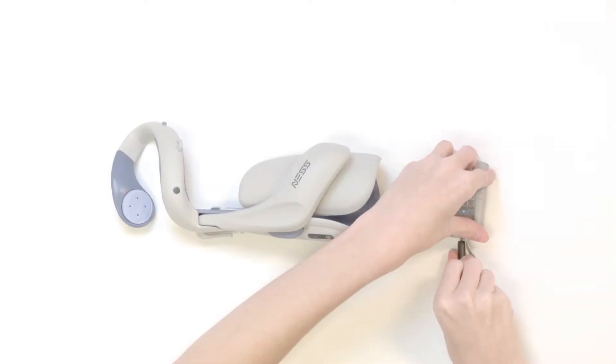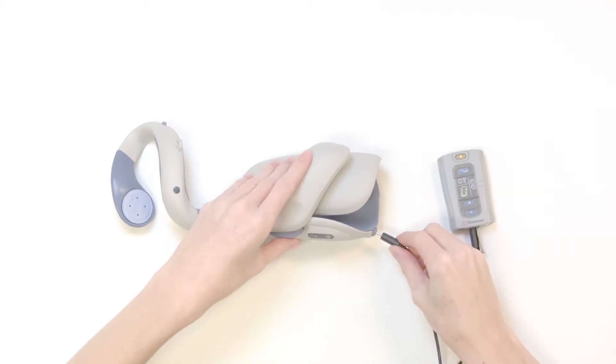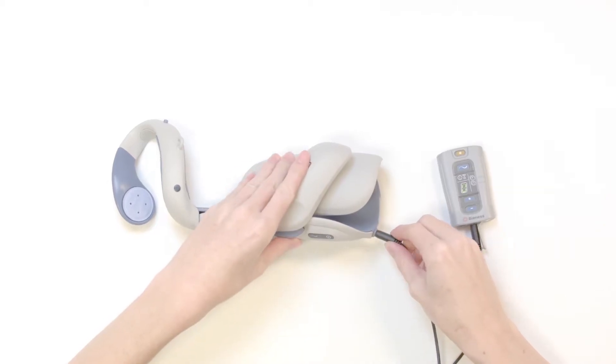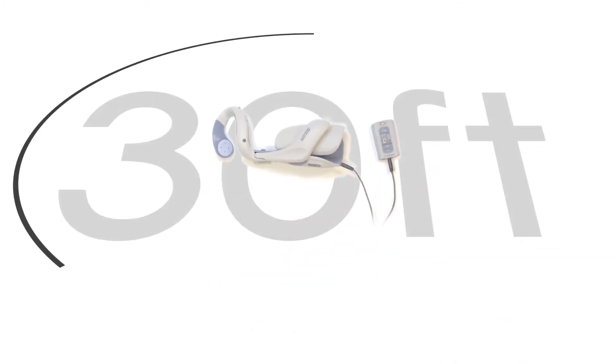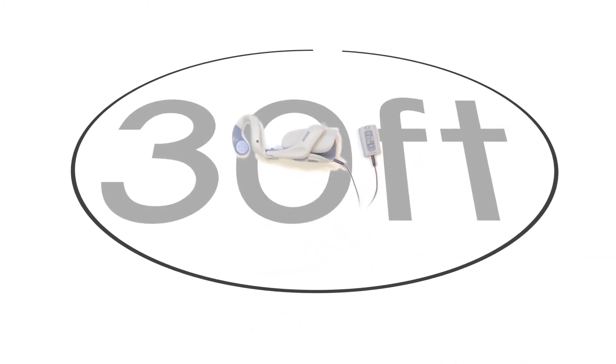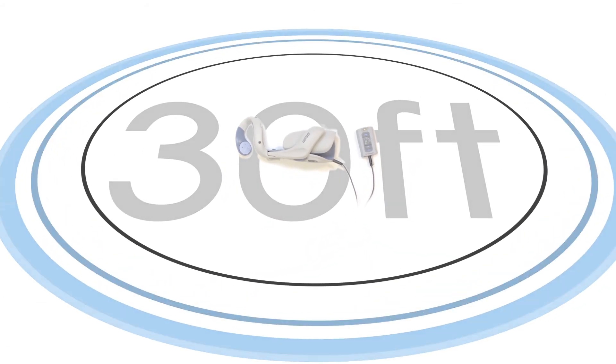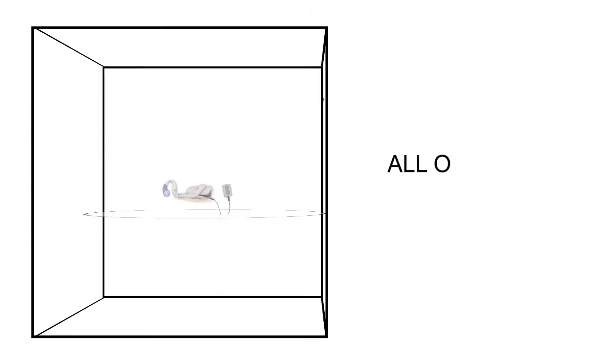First, confirm you have the correct H200 wireless components and plug them in so that they are charging. Next, make sure your H200 system is 30 feet away from any other Bionis systems. Put them in another room.